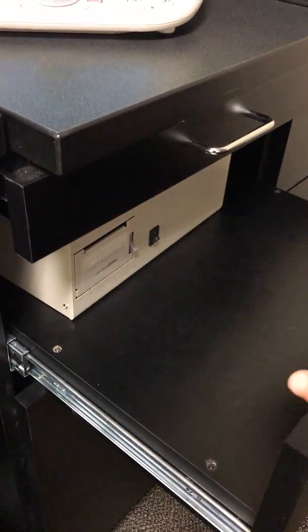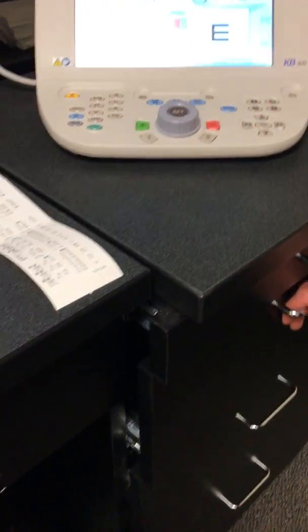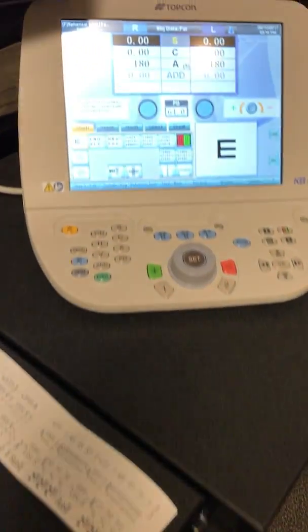To begin, open the drawer and turn this button on. That'll turn the machine on. It does take a moment to set up, so that should be the first thing you do when you come to the office.